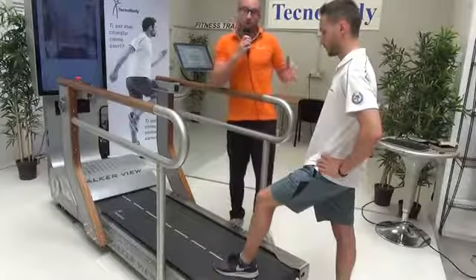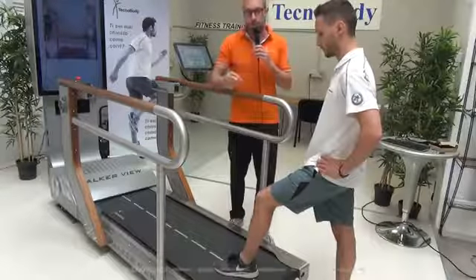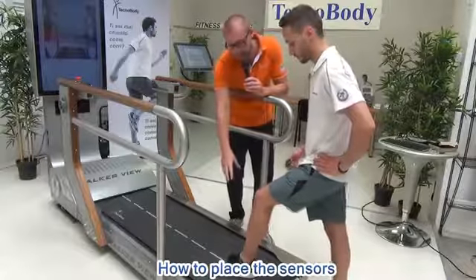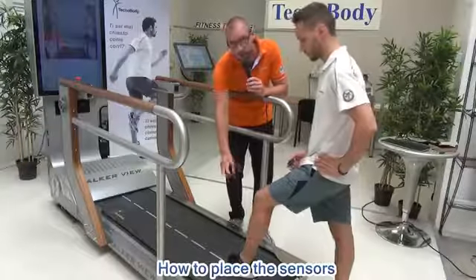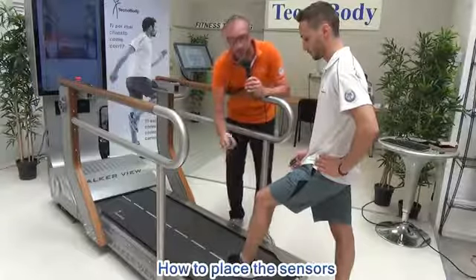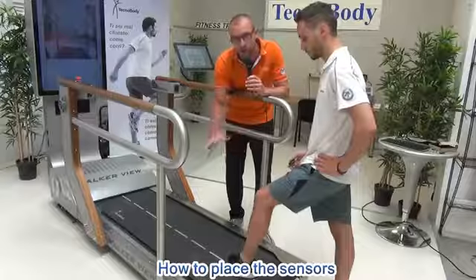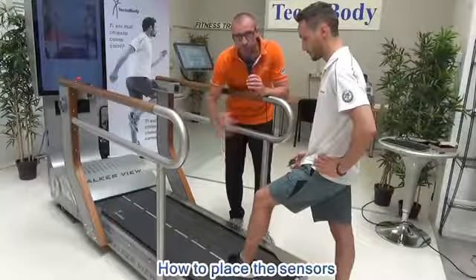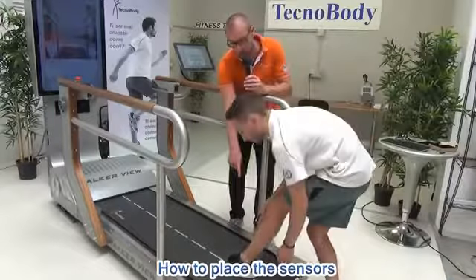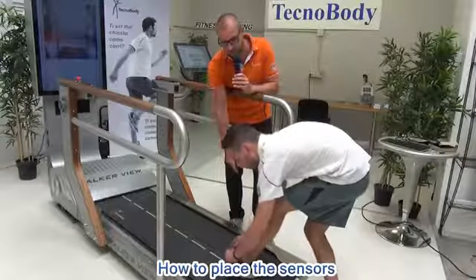So we see now how in practice these sensors are working, how we can apply these sensors on the feet. As you can see, there is a little elastic pocket on the shoes that is very flexible, and it allows to fit this pocket in all kinds of shoes and for all kinds of dimensions of feet as well. So on this pocket we're going to introduce the inertial sensors.